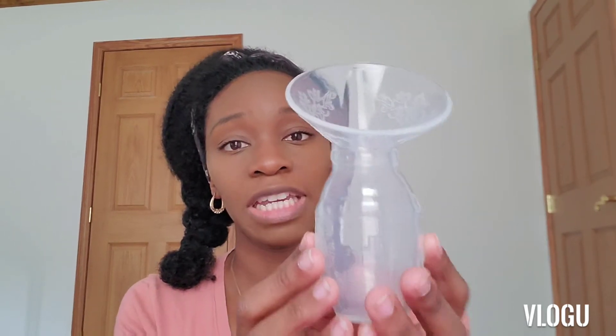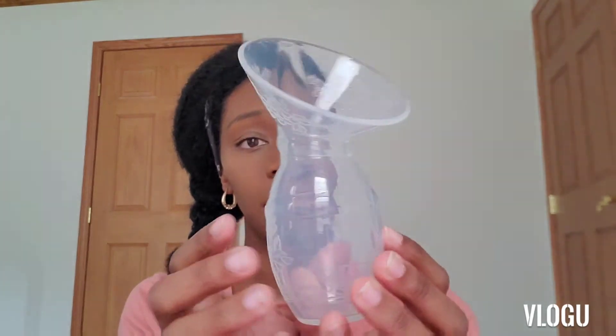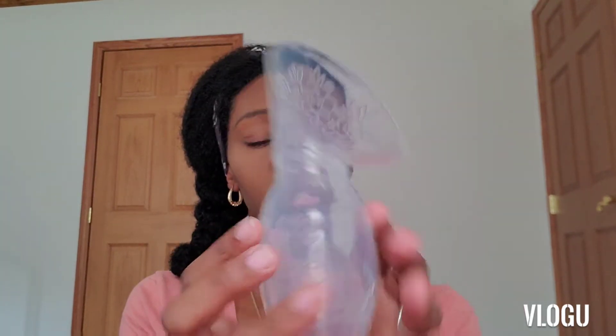This first pump is a silicone pump that I got from eBay, and it is just a squeeze pump. All you do is put it on your breast and you squeeze, and it suction cups to it, and then it catches the milk in the bottom, and then you can pour the milk into your storage bags, or a bottle, or however you store it.